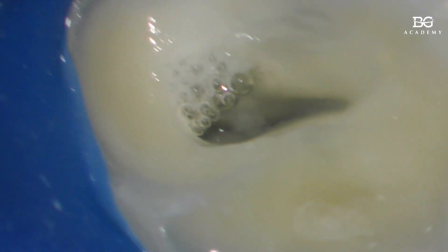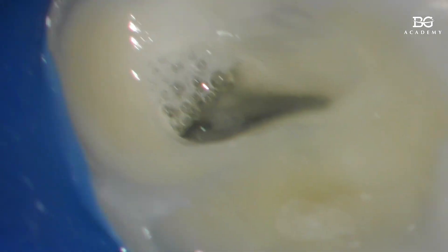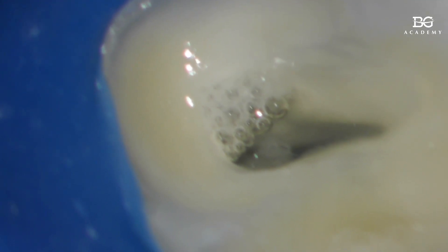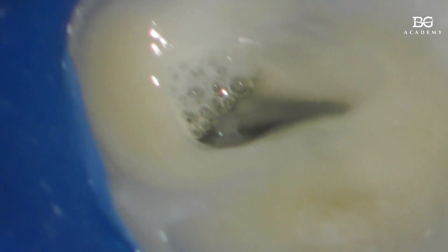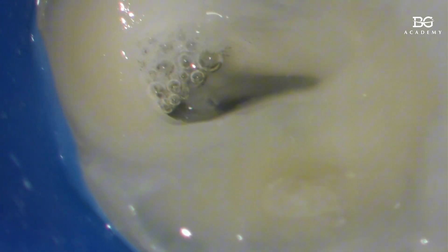We rinse, then recapitulation with X1, rinse again, then recapitulation. One thing I didn't mention: when we switch to the red 25 instrument, I set it 0.5 millimeters shorter, because during instrumentation the working length can decrease. Do you understand why? It was a curved canal, and due to the taper you trimmed the walls, so your canal became straighter. That's basically the whole story.